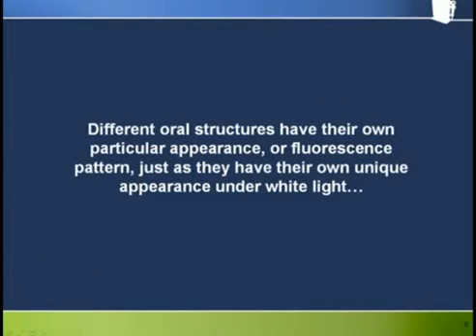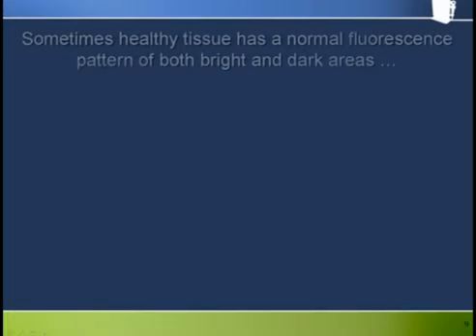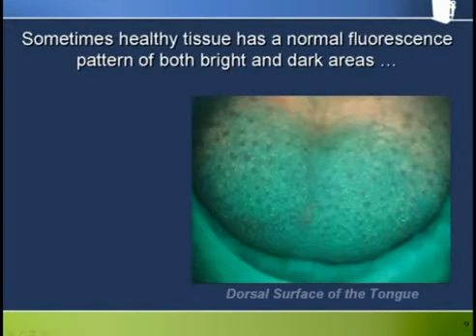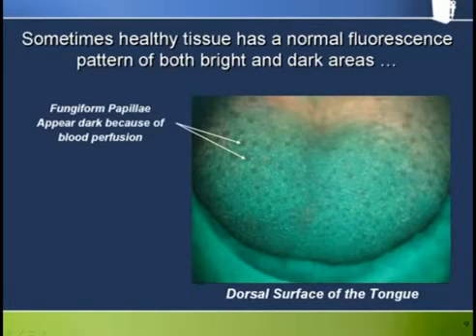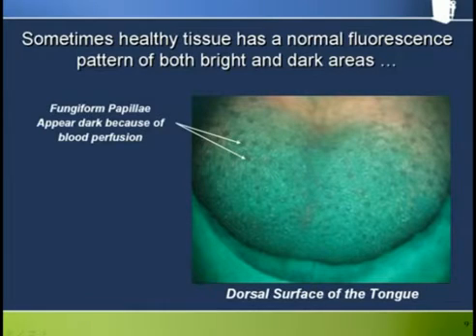We have to remember, with fluorescence visualisation, different oral structures have their own particular appearance or fluorescence pattern just as they have their own unique appearance under white light. Here we see that healthy tissue has a generally homogenous pattern of bright and dark areas. The dark spots are the fungiform papilla that appear dark because of blood perfusion and the lack of much keratin, and the smaller bright spots are the filiform papilla.